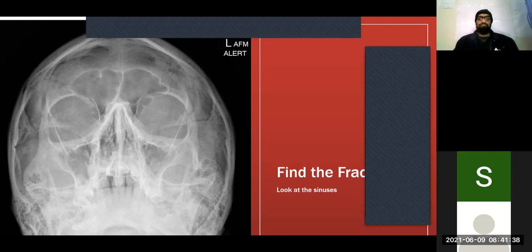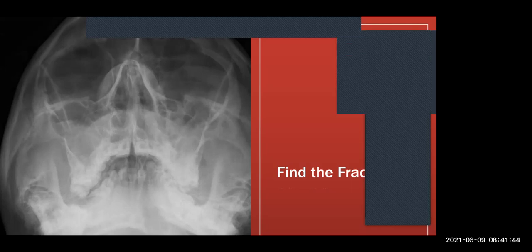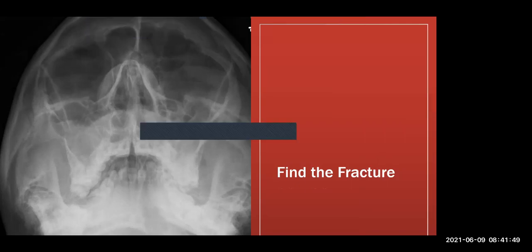Okay, so let's try another one. Anybody want to volunteer to look at one? Let me hide all of this. Wait. Video panel, hide floating controls. Okay. Anybody want to give it a guess? Go. This is actually an easy one. If you can't get this one, then we'll restart the whole lecture from the start.